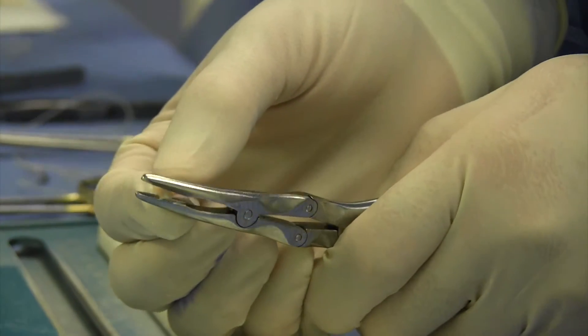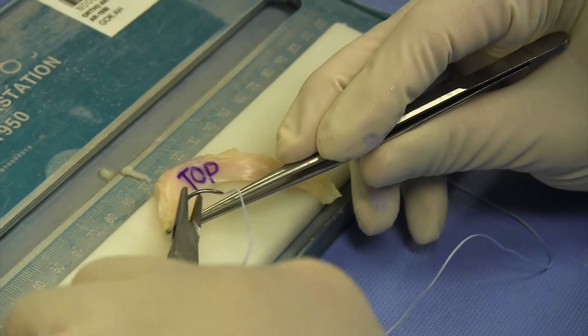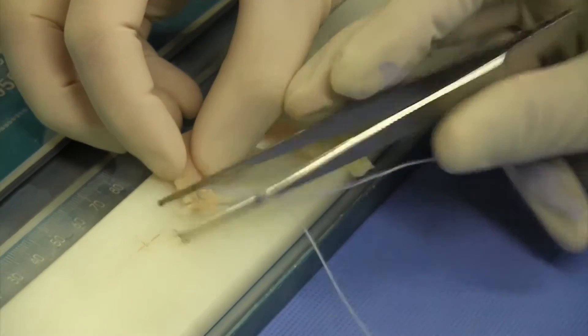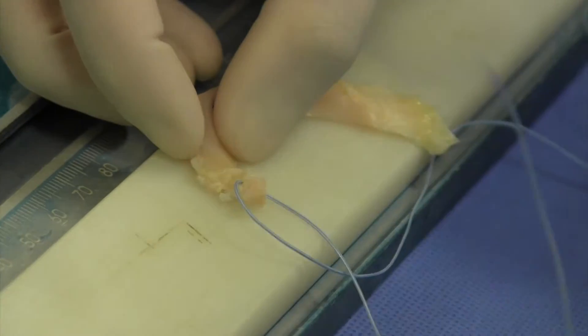Then I prepare the plug. The plug is prepared with a suture, and with that suture I can pull the plug into a socket in the knee of the patient at the anatomical position of the meniscus.